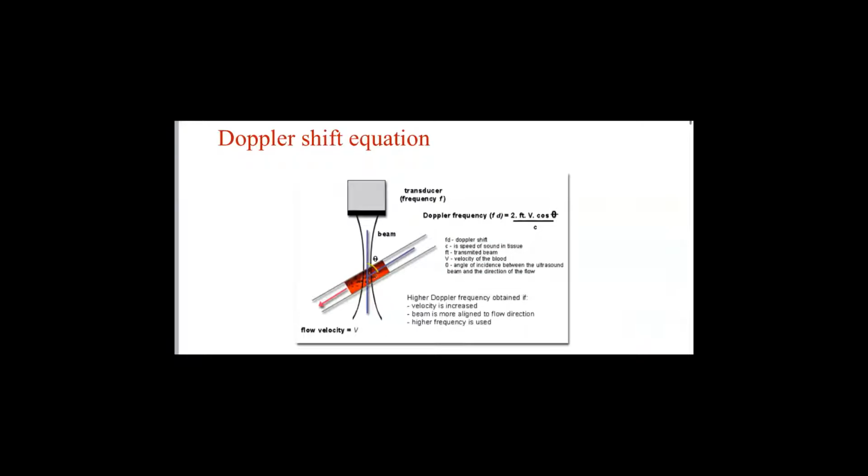The Doppler shift equation. Are you familiar with this equation? Yes, no? No. Really? Well, if no, then this is a good chance to discuss it, because it is at the center of the ecophysics.